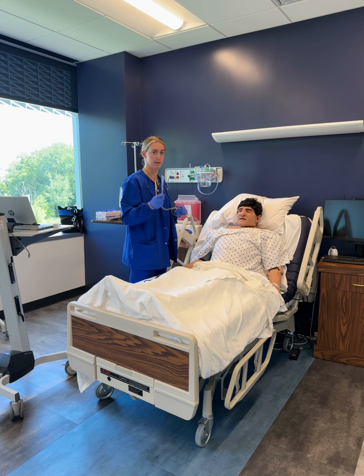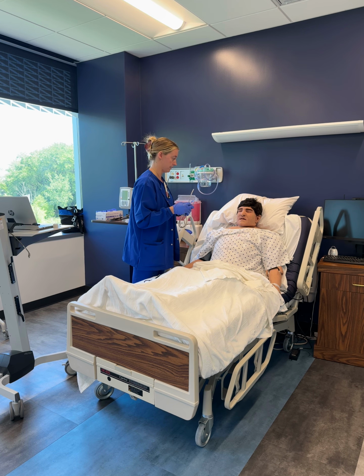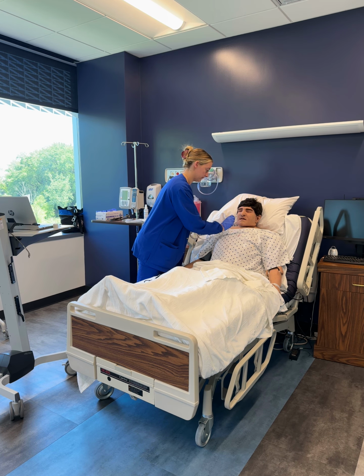I'm going to have the patient put their chin to their chest, and every time I insert, I'm going to have you swallow. This will not go in all the way, just to let you know. So we're going to go in and go back towards the ear.